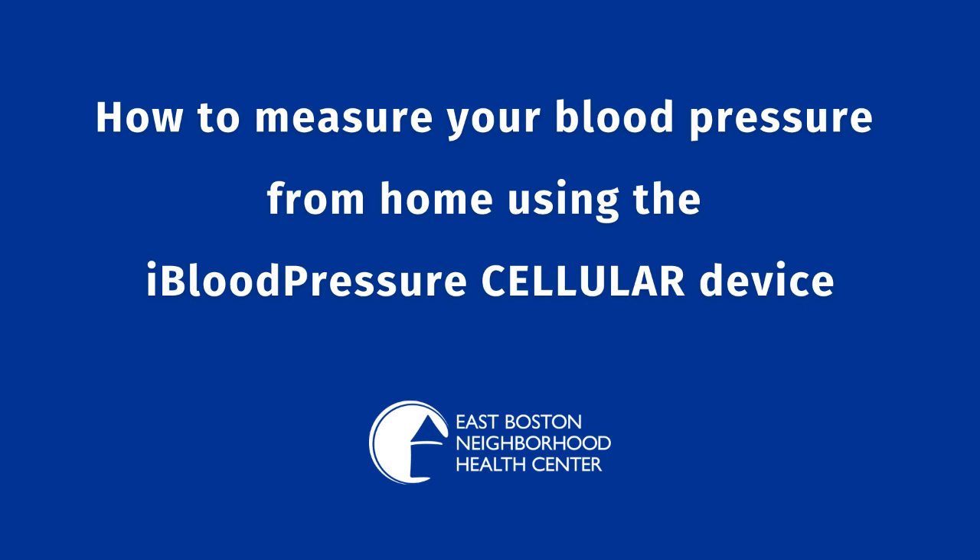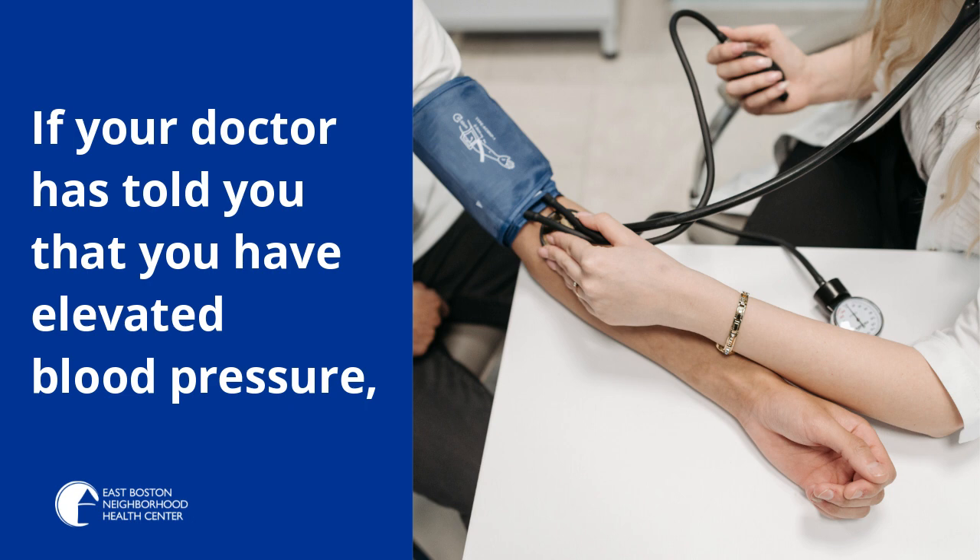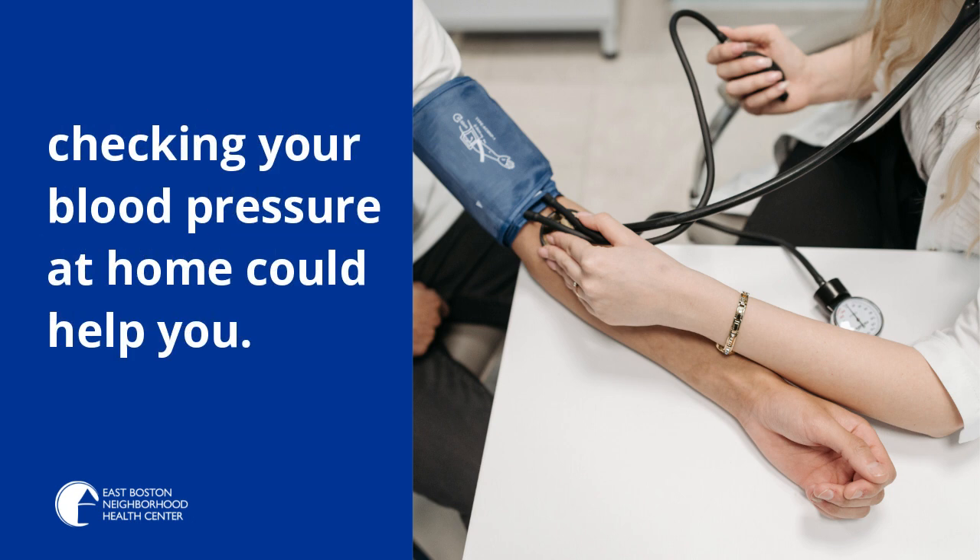How to take a home blood pressure reading with the iBloodPressure cellular blood pressure device. If your doctor has told you that you have elevated blood pressure, checking your blood pressure at home could help you.